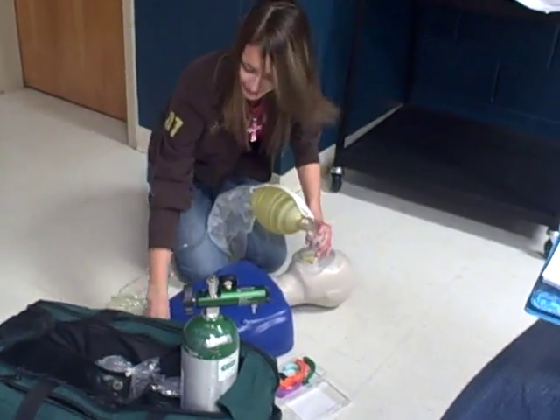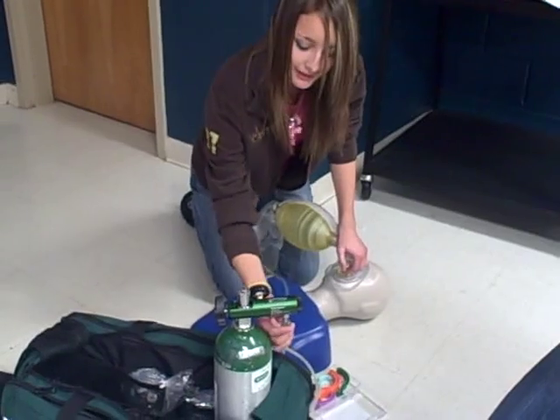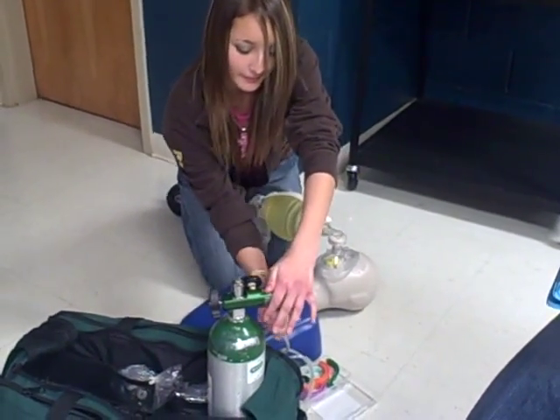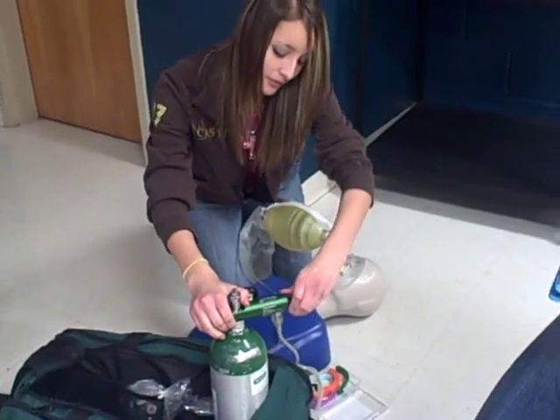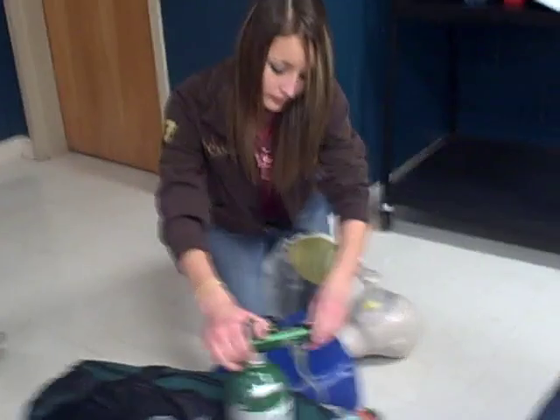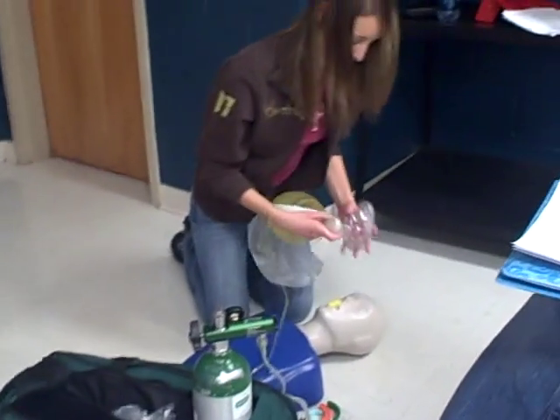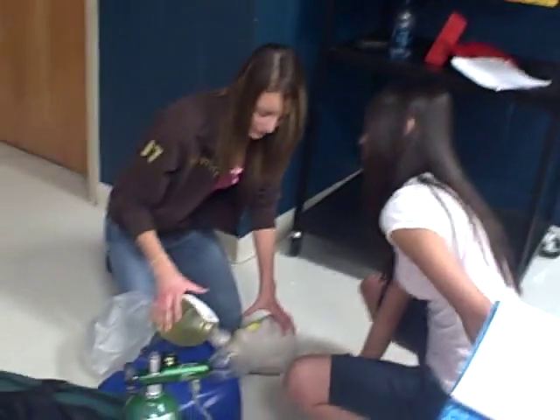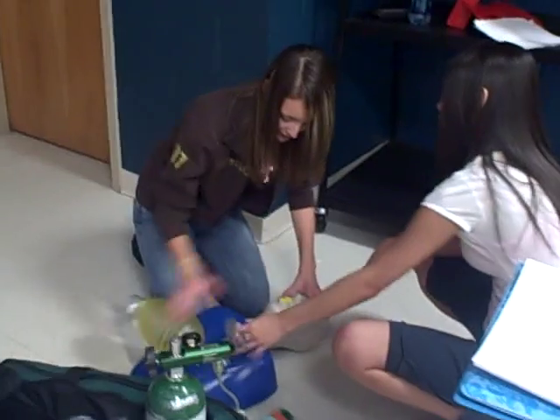Now we've attached the reservoir to the oxygen tank and turned it on to 15 liters per minute. The second EMT will come help you. We reopen the airway — head tilt, chin lift.